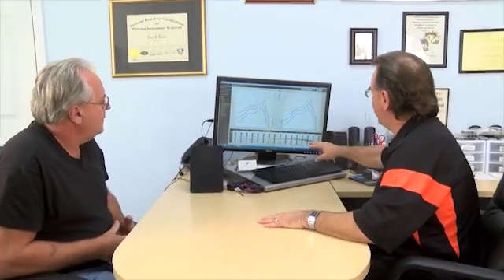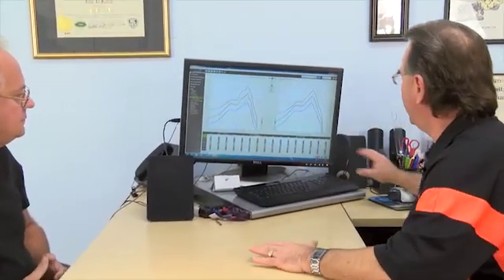So what we're going to do is we're now going to read the hearing aids. Now what this is showing is the programming graphs. We're going to go into fine tuning. And this is an equalizer bar. Imagine an equalizer on a stereo system. We're able to move these up and down.